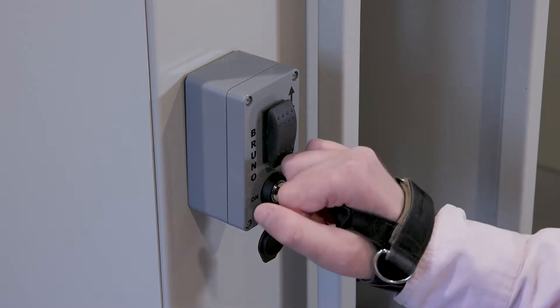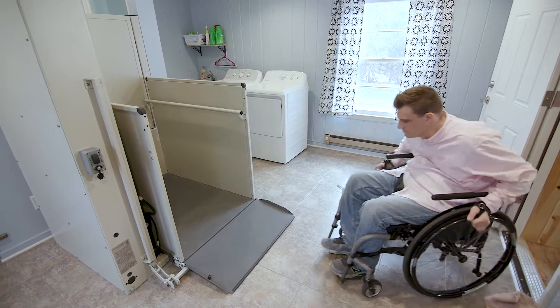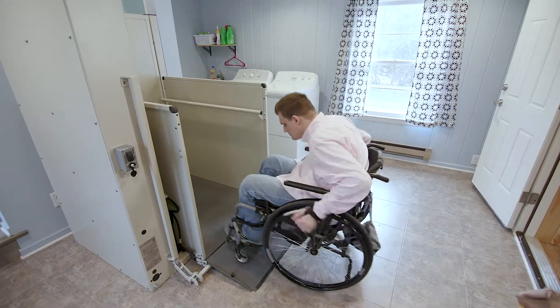Just press a button and the ramp automatically folds down. Roll onto the lift, press the button, and enjoy a smooth, quiet ride.